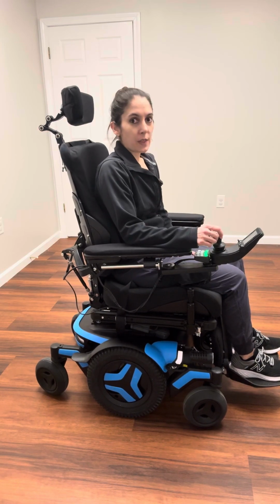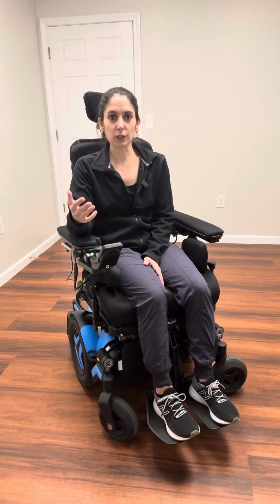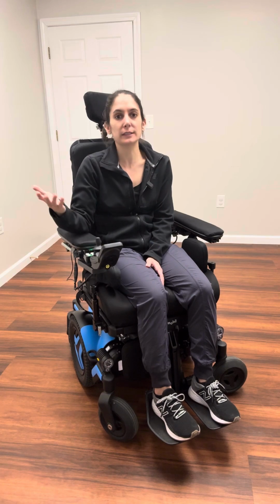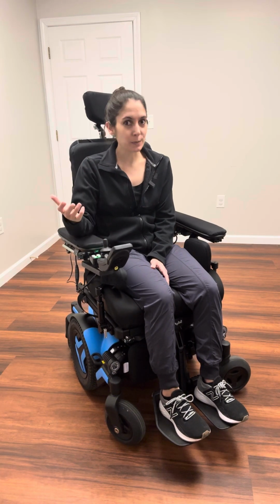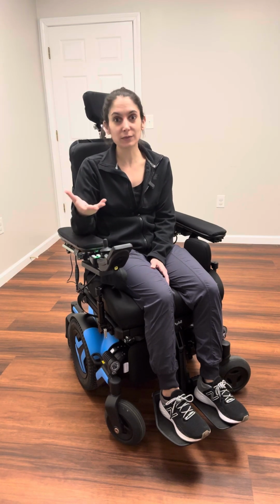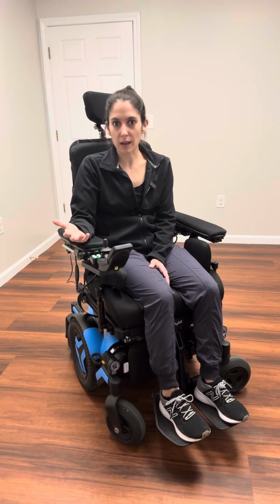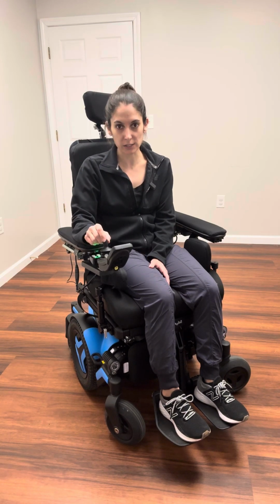So one isn't better than the other in general. They're all good drive systems. It just depends on what you need and what is important for your life and what you are navigating over. So you want to think about things like, what is your home setup like? How frequently are you driving indoors on flat ground versus outdoors on more uneven ground? Those are the things you should be bringing up to your physical therapist and your ATP as you're having this conversation.